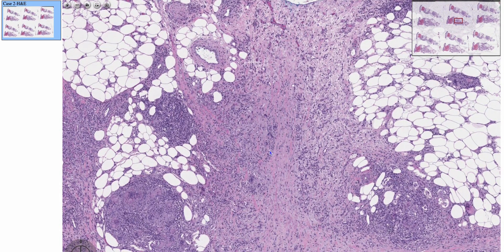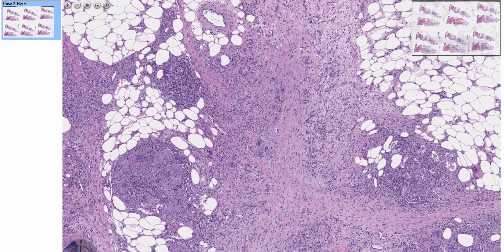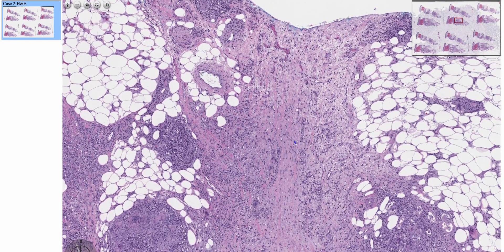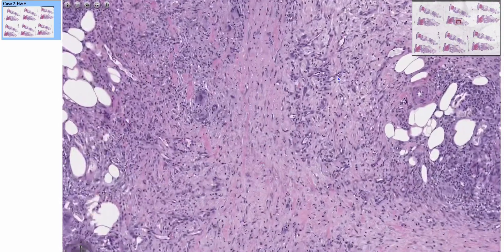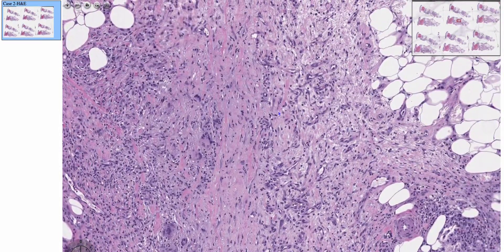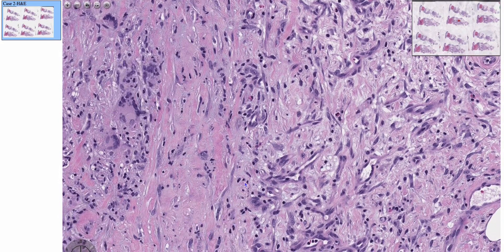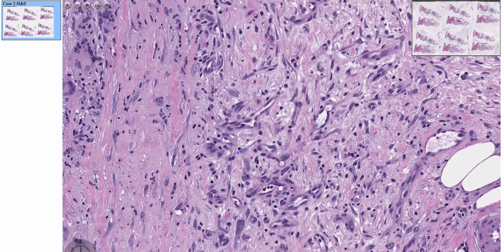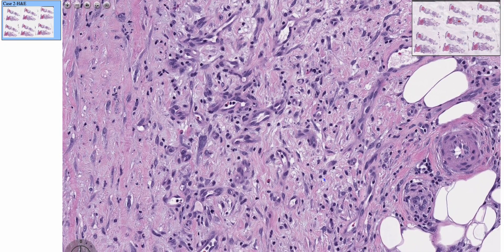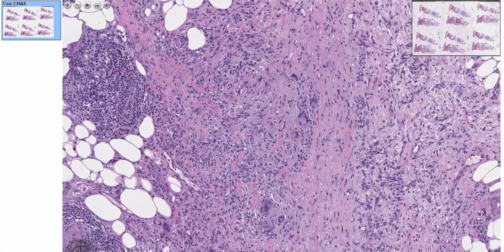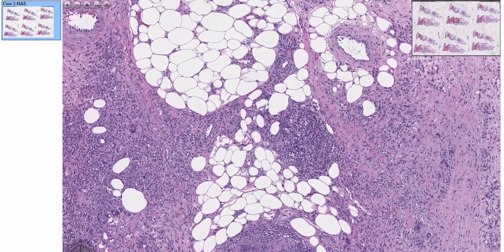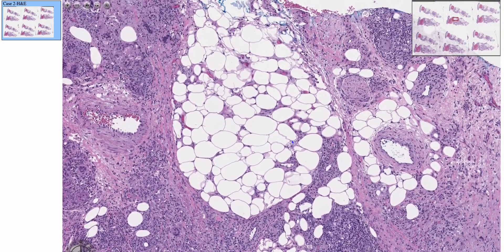Depending on the stage of erythema nodosum, you'll get mixed inflammation. If it's acute, you'll get predominantly neutrophils or more neutrophils in the septum. In later stages, you'll get histiocytes and lymphocytes. As we can see here, I see predominantly lymphocytes and some histiocytes, so this is more of a chronic stage. There's a lot of fibrosis in the background as well. And then you'll also get some inflammation spilling out into the lobules.